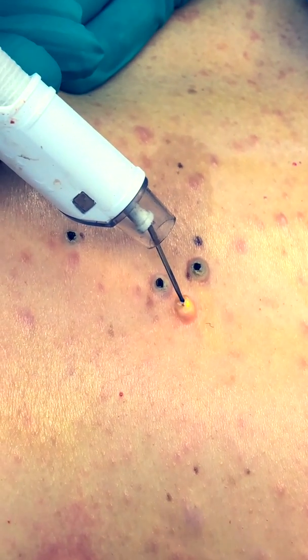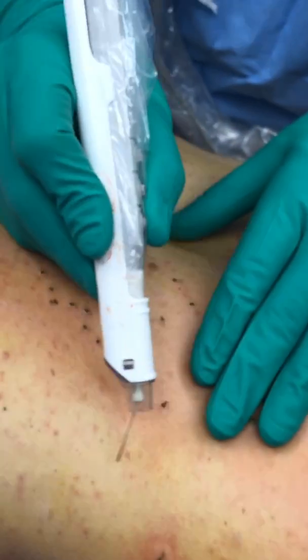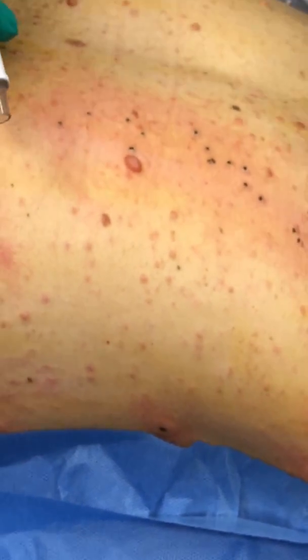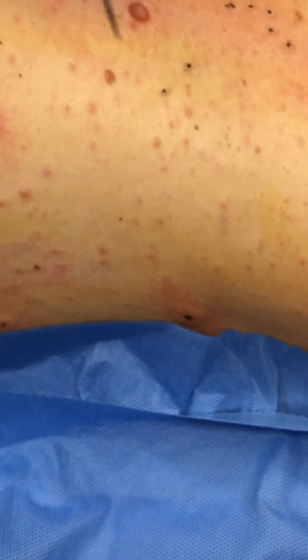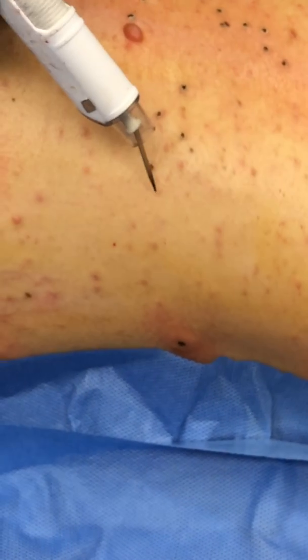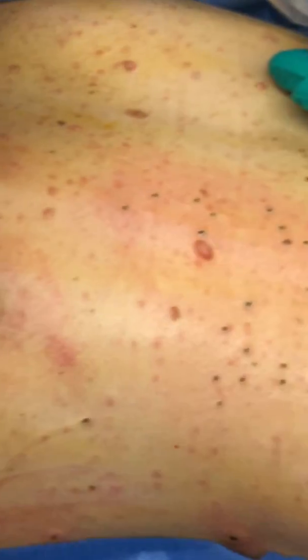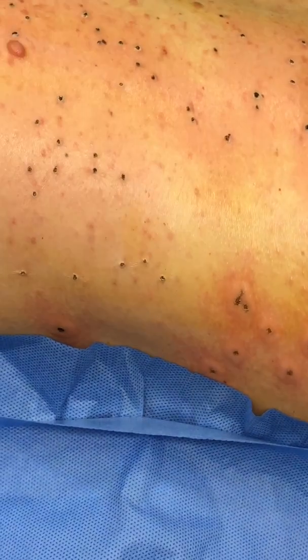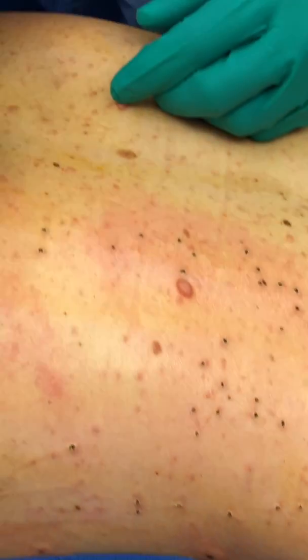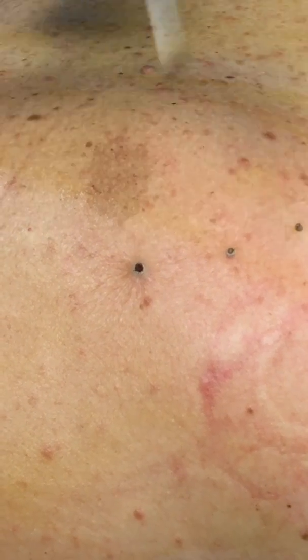One thing I do with electro desiccation: when bumps are very fine they're difficult to see in certain lighting conditions. I preferentially cast light at different angles to bring those bumps out so I can see and zap them. Sometimes I don't even use overhead operating room lights because they're too bright and wash out the bump and its shadows. Here I'm using the fluorescent general room light to see the shadows better, and then I'll cast the overhead lights at certain angles to make sure I've gotten them all.